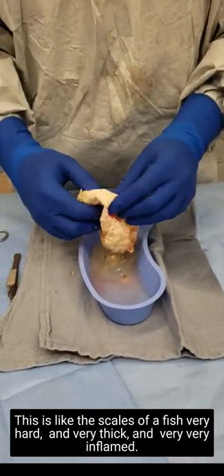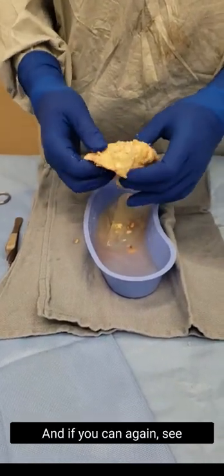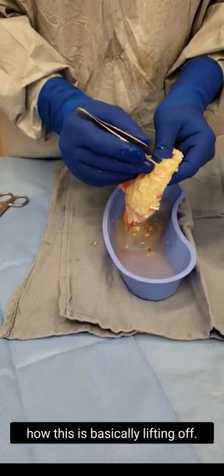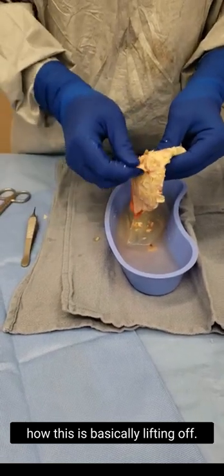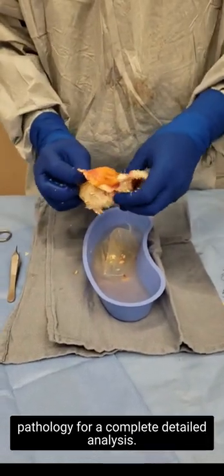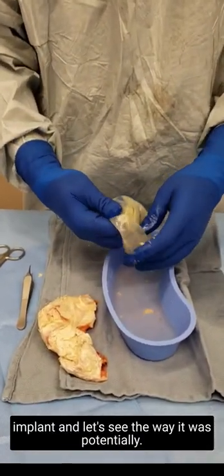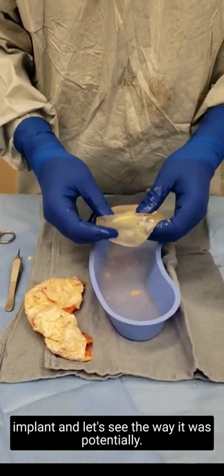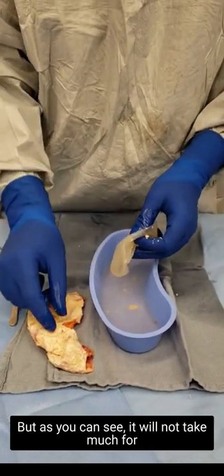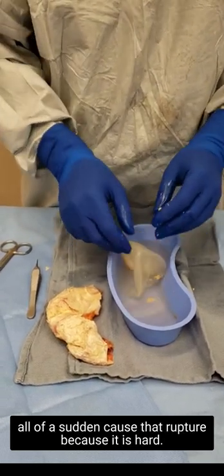Very thick and very inflamed — look how razor sharp this is. You can see how it is basically lifting off, and again all done in en bloc fashion. The capsule will be going to pathology for a complete detailed analysis. There's nothing abnormal that I find, but look at the saline implant and the way it was. It would not take much for one of these scales to cut in and cause a rupture, because it is hard.